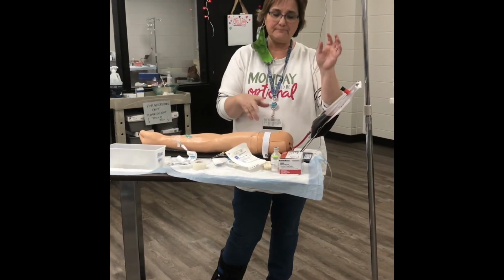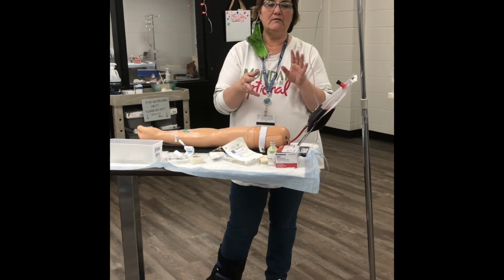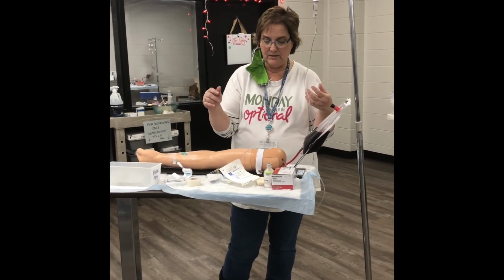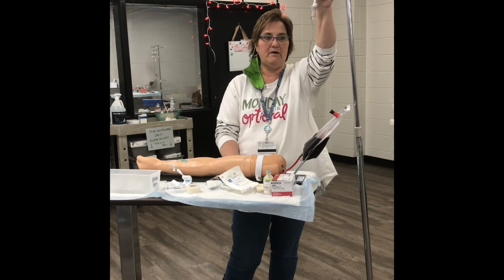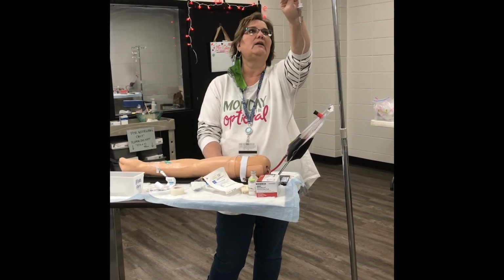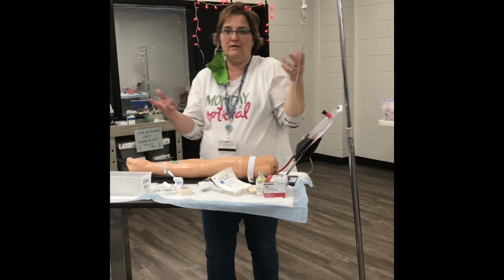So, all right, we're going to come in, identify your client, explain to them what we're going to do, and wash your hands, or do hand hygiene. I'm going to stop my fluids, taking note of how many milliliters are left in my bag. It's an estimate. I mean, you don't have to drain this and measure it. I'm looking at this and it's almost full, so about 220 milliliters.